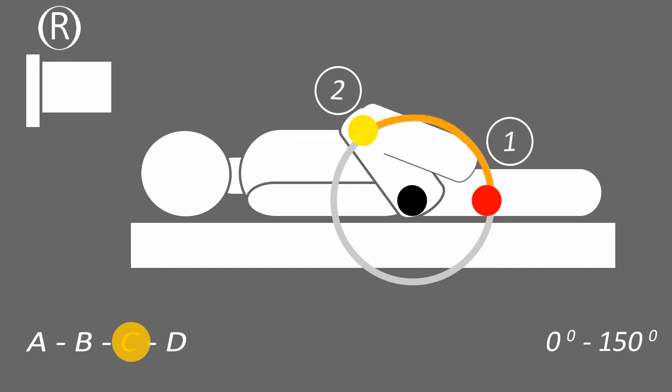The red dot should be centered over the middle of the lateral aspect of the pelvis, and the yellow dot is positioned parallel to the long axis of the femur on the lateral aspect of the thigh, with the knee bent during motion as shown in the guide image. The angle measured will be automatically displayed, and when you click Save or Next it will be captured in the database.